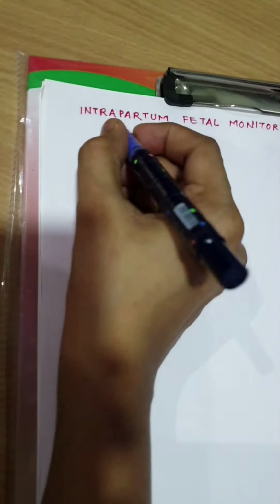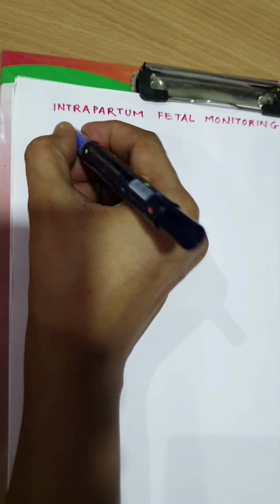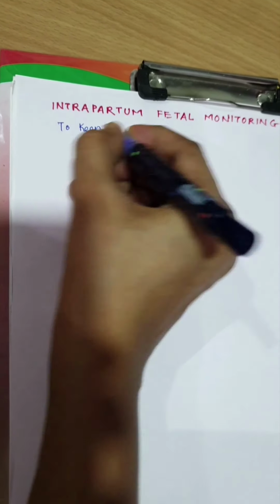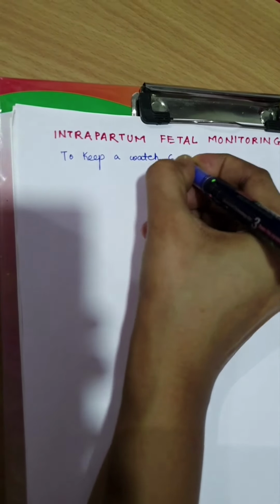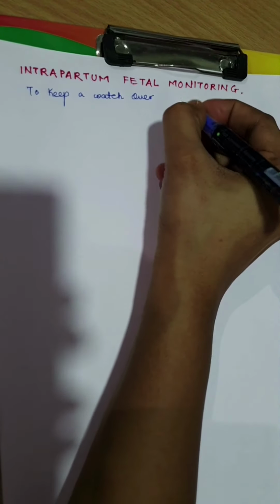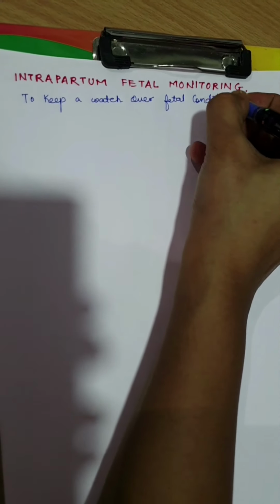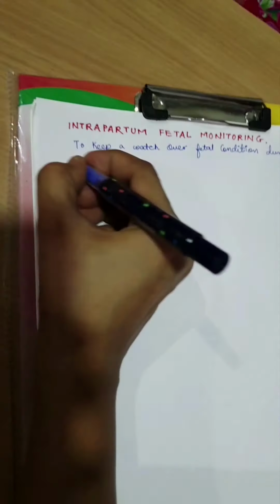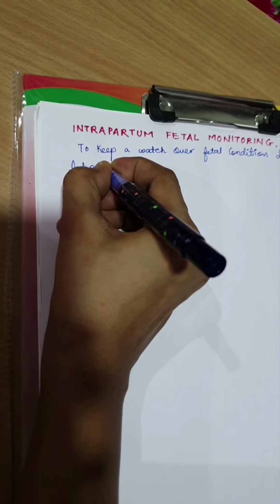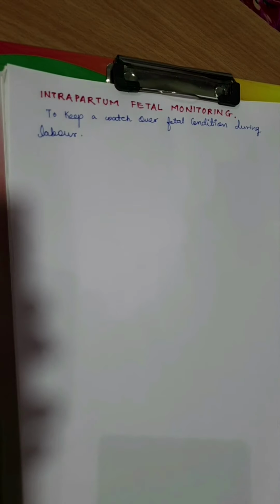So we can define it as: it's to keep watch over fetal condition during labor. So in fetal monitoring we just keep a watch over the fetal condition during the labor.